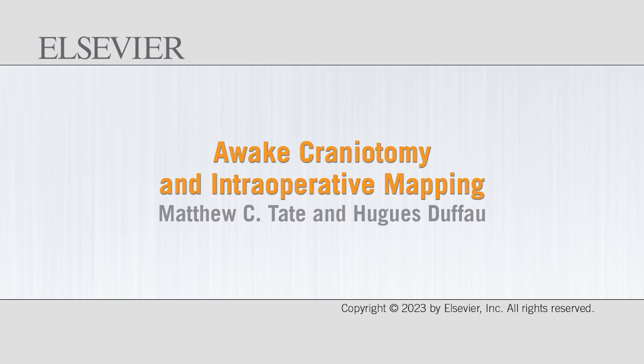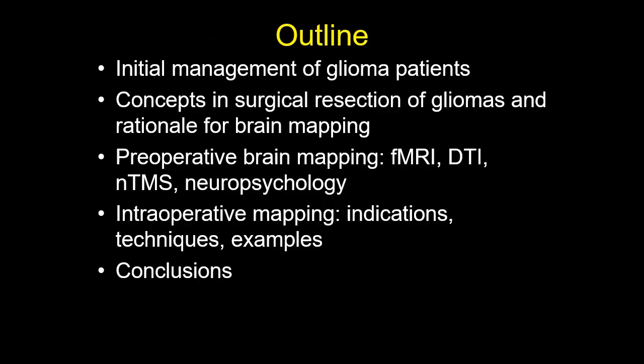This is Matthew Tate presenting an instructional video on awake craniotomy and intraoperative mapping on behalf of myself and Dr. Hugues Duffau. During this presentation, we will discuss the initial management of glioma patients, concepts regarding the surgical resection of gliomas and the rationale for brain mapping. We'll then focus on preoperative brain mapping techniques, including fMRI, DTI, navigated transcranial magnetic stimulation, and neuropsychology assessments. We'll then move on to intraoperative mapping, general indications, techniques, and patient examples, and we'll finally end with some conclusions.